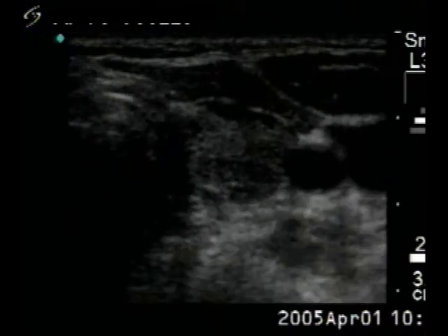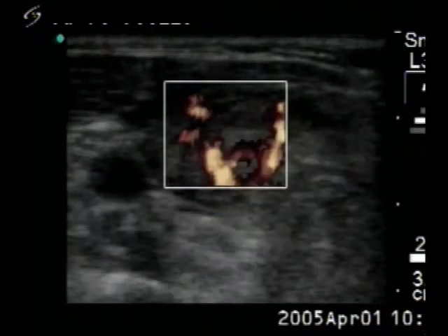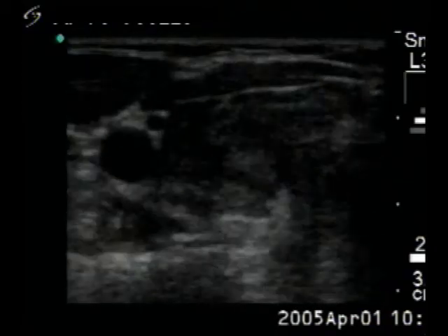And finally, the left lobe is demonstrated with the usual hypoechoic pattern.